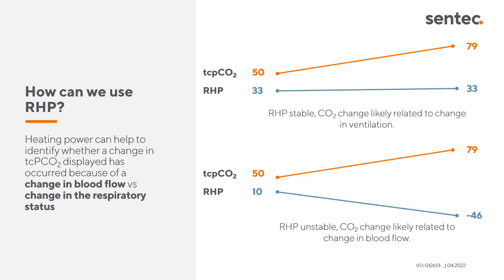In both cases, it's important to first assess the patient and their respiratory status before troubleshooting the transcutaneous CO2 and RHP.